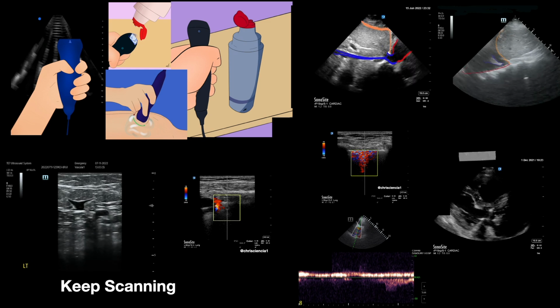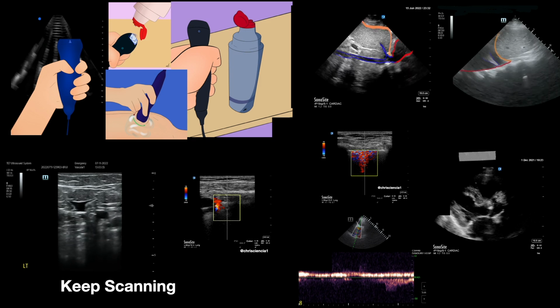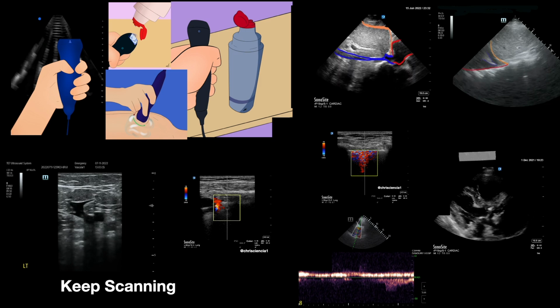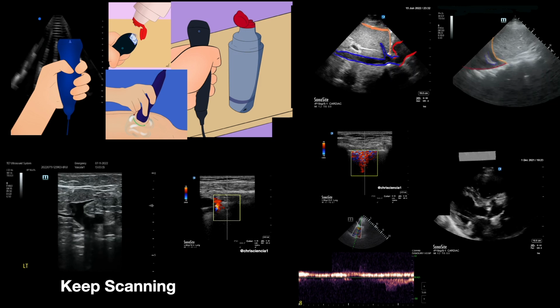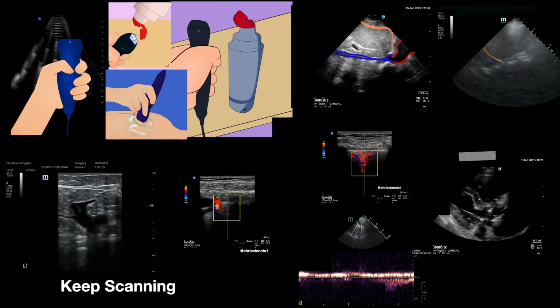The only way to get to master point of care ultrasound is scanning, and of course, having a mentor and having timely, real-time feedback. This is very important, if you have feedback in real time.